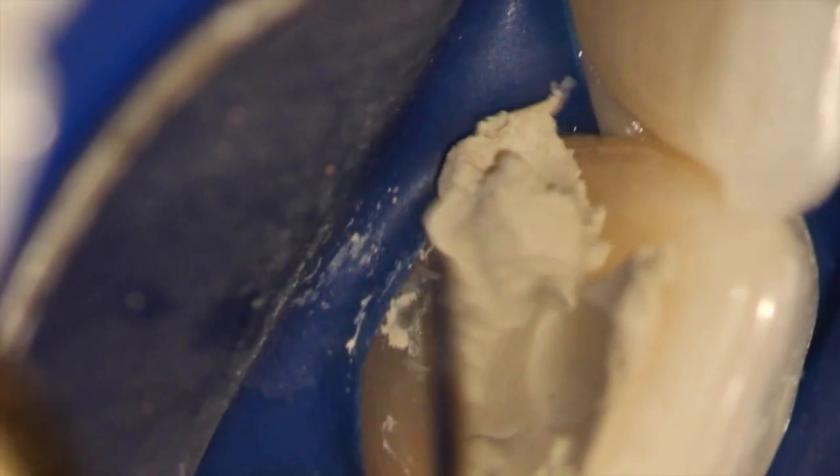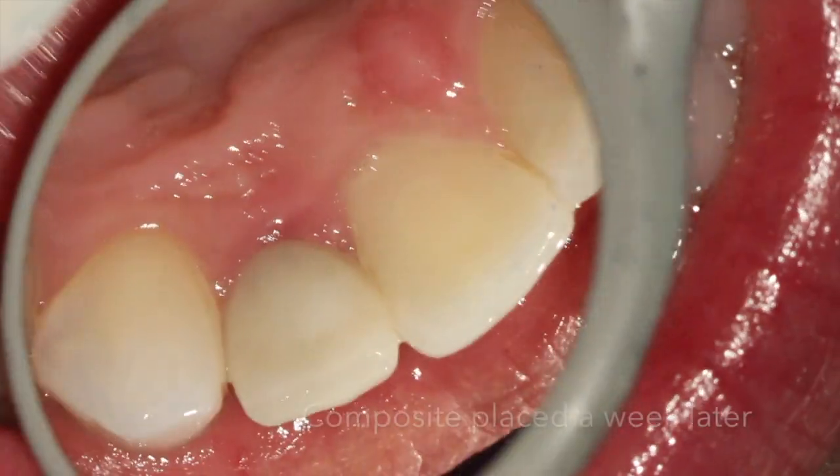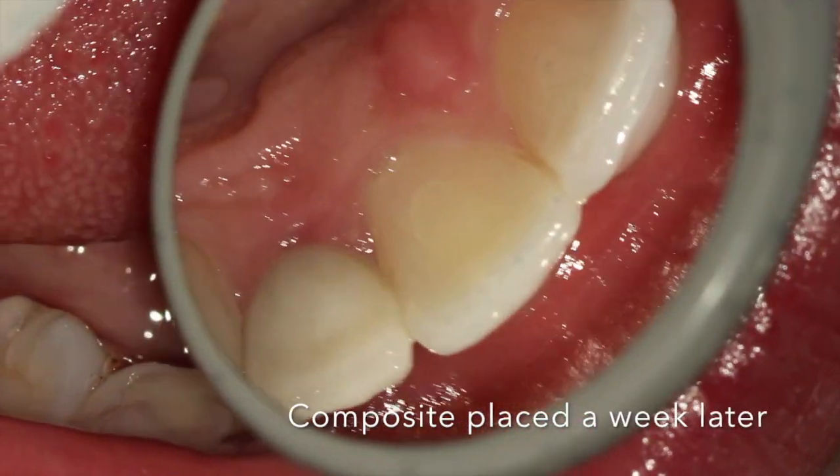I like to put cavit to close it — and I like doing this part, it's kind of fun — and we close it so it's easier to remove. A week later, the patient comes back if they're happy with the new shade. We take out the bleach and the cavit and restore the tooth with composite, as in this case.